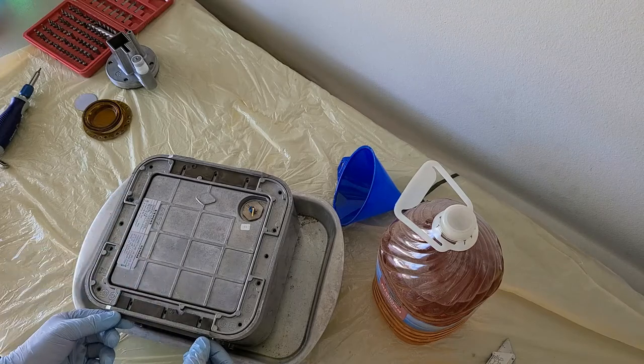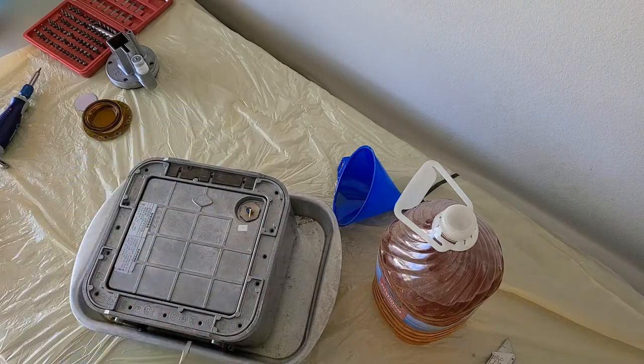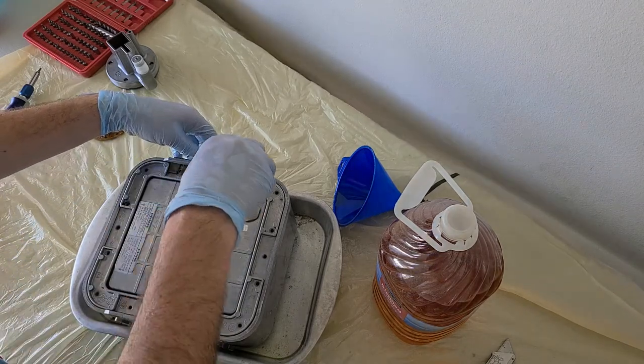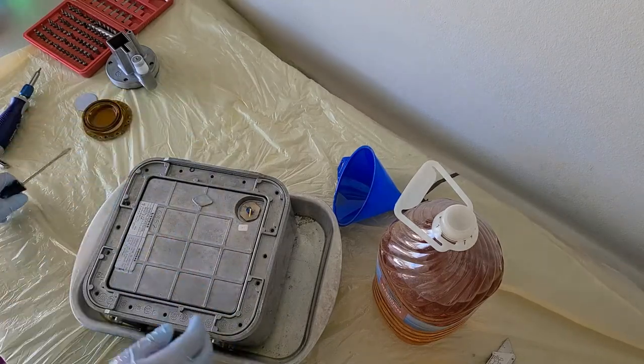This little holding bar slides out the side, I just found out. There's a little slot right here that it can go through. It looks like that holds this top piece in place. All right, that should be it.